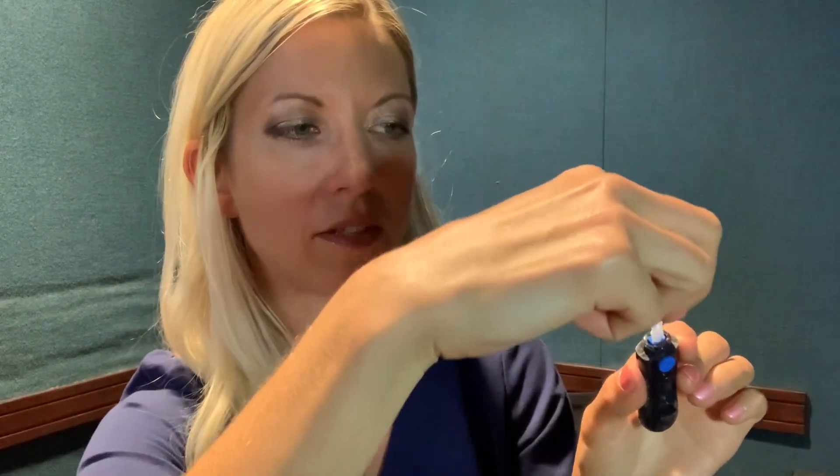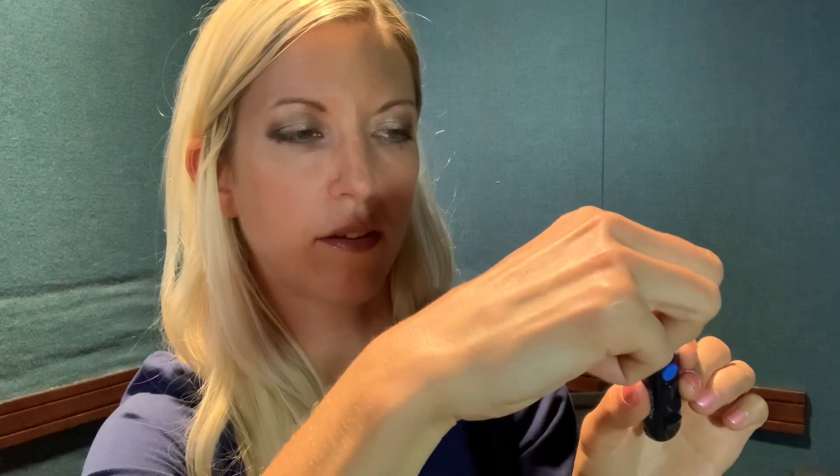The top will just twist off like that, and in here is where you're going to load a new lancet. That exposes the needle, and then you're going to twist the cap back on top just like that. This little number device here is going to adjust the depth of the poke. If you want a more shallow poke, put it all the way down to one and adjust it upwards until you get the blood sample amount you need.